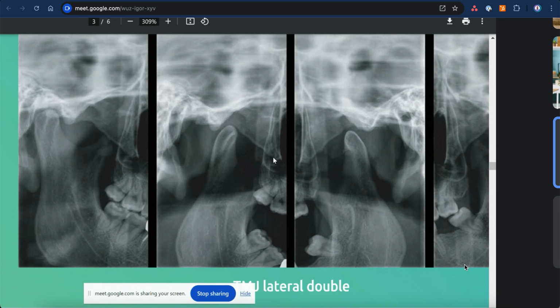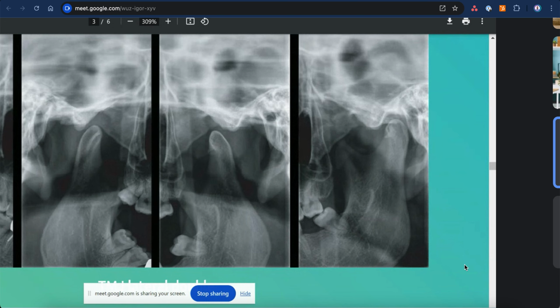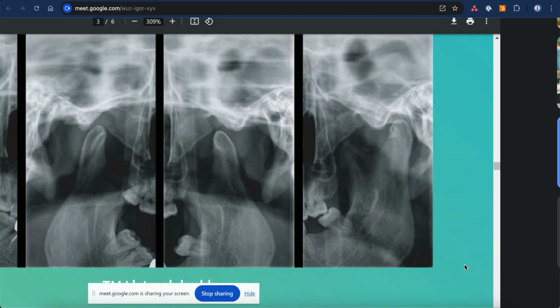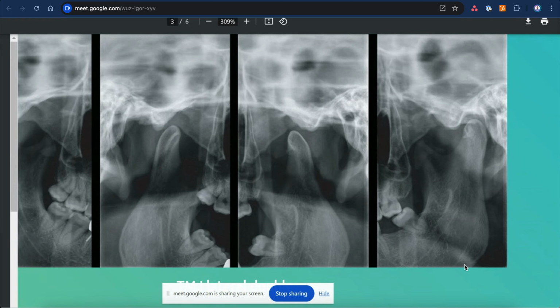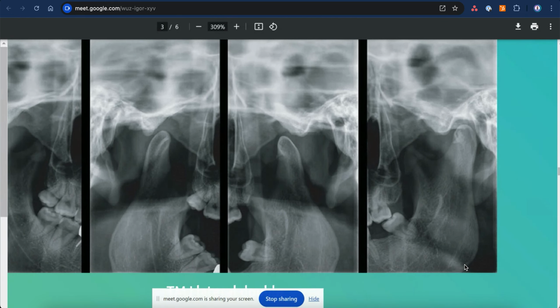Many patients complain of some pain. It's very complicated, and there are maxillofacial surgeons specialized just in the treatment of the TMJ. It's the most complex branch of dentistry, the TMJ disorders. Everything is vague about it. So specialists need a very, very high resolution image to identify the changes that have happened in the condyle and the coronoid, this is the coronoid bone, okay?